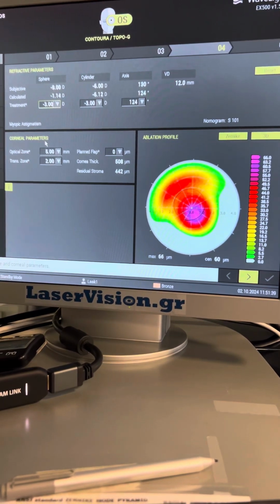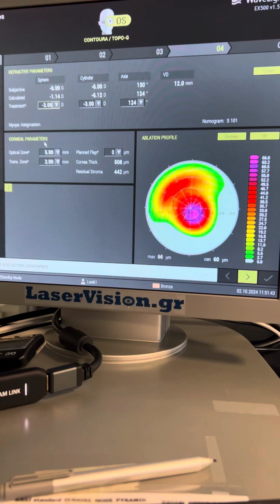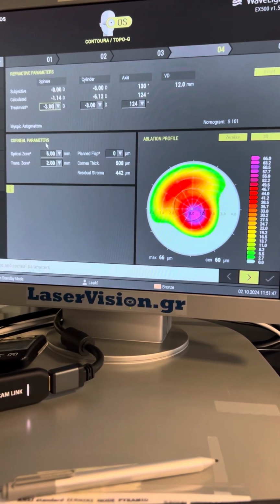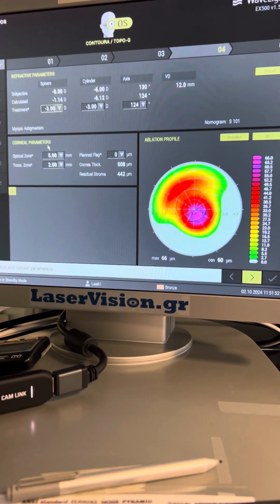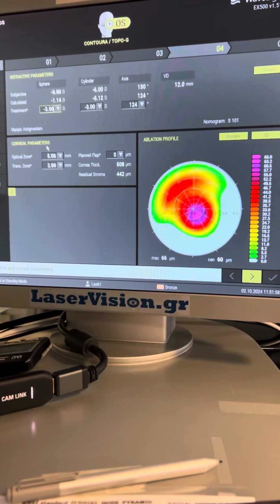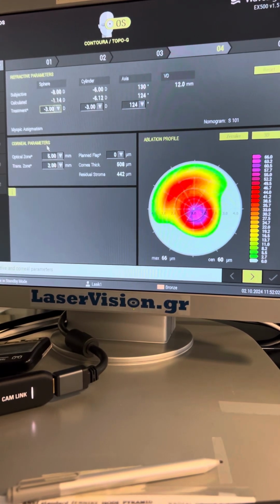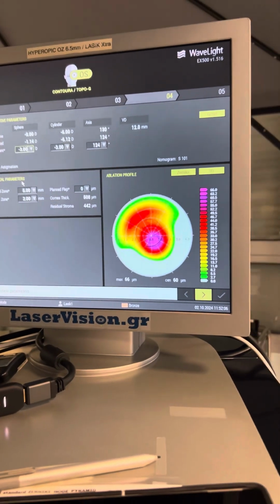And we'll couple this with a PTK, which is also something that's not available in the US, that we will treat in a diameter of 7.5 millimeters, 50 microns, to remove the epithelium and use the epithelium as a masking agent for the correction. And then follow with what we have introduced as higher fluence, 6 milliwatts per centimeter squared for 15 minutes. So this is in essence the Athens protocol design in our laser center live today.